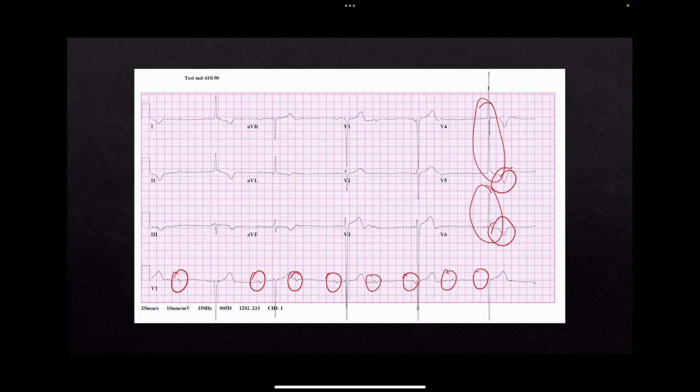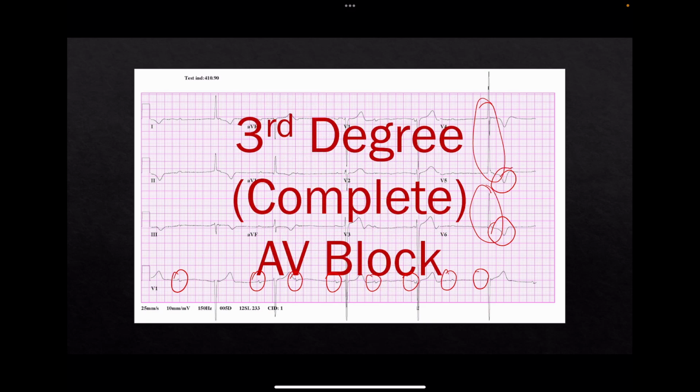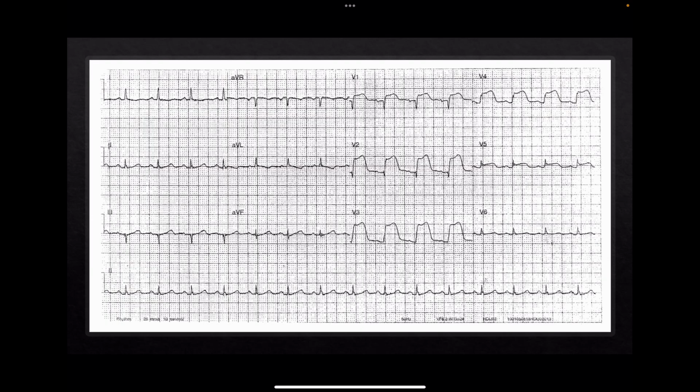Now, on your quiz and your exam, you're going to have the answers in front of you. So if you see an answer that doesn't include yours, you're like, hey, I better look closely and see what else is there. At least you have the opportunity to have 4 answers in front of you, and the real EKG, you can figure it out. Always look at everything. Yes, you will see other things there as well. Don't get confused by just the hypertrophy. You have to look at everything.